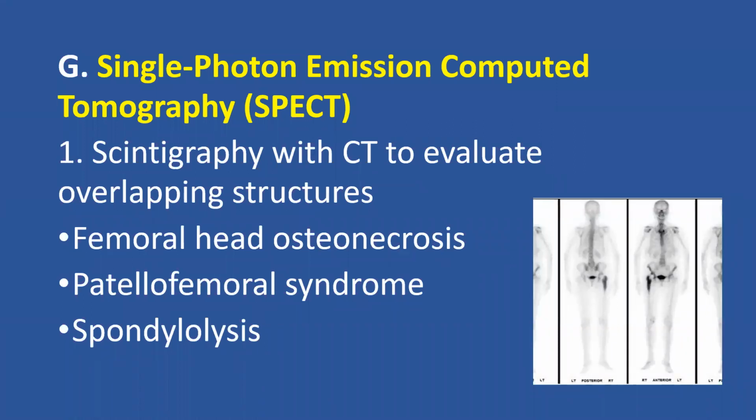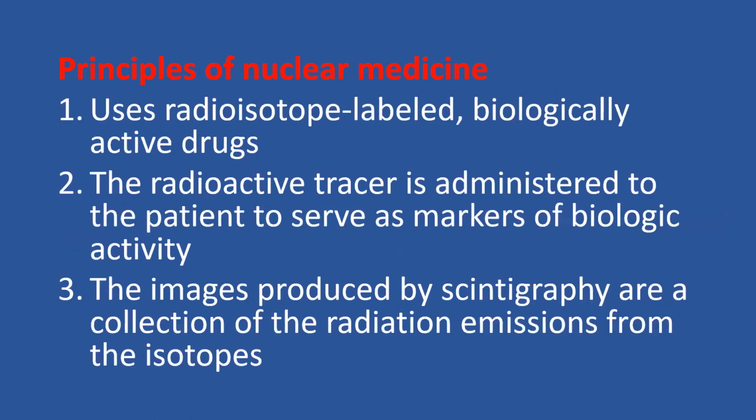Single photon emission tomography is scintigraphy with CT to evaluate overlapping structures. It helps in evaluating head osteonecrosis. It helps in evaluating patellofemoral syndrome or jumper syndrome. And last but not least, spondylolysis.